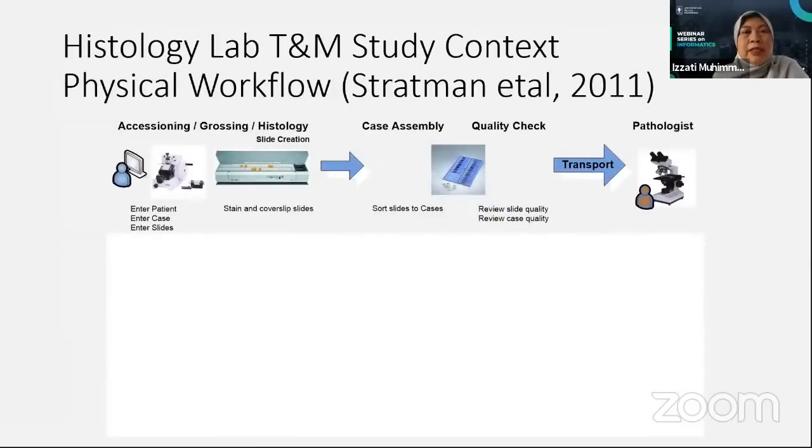This is the illustration of the workflow that is usually done in manual slide reading. There is a patient whose sample needs to be taken, and then the laboratory woman or man will create the stain and the histology glass slide.